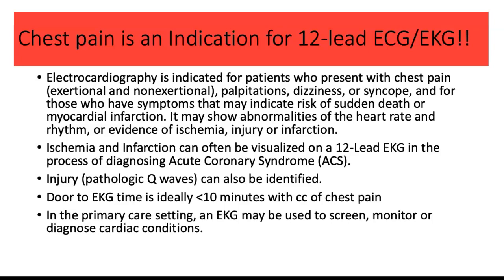Ischemia and infarction can often be visualized on a 12-lead EKG in the process of diagnosing acute coronary syndrome. EKG can also show evidence of prior myocardial infarction with pathologic Q waves. Ideally, we'd like the EKG in less than 10 minutes. In the primary care setting, an EKG may also be used to screen for, monitor, or diagnose cardiac conditions.